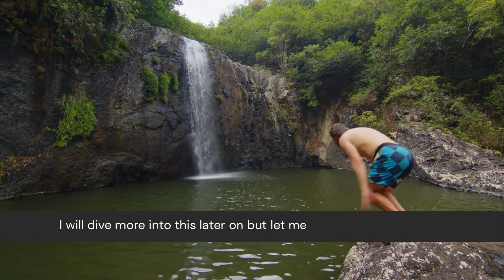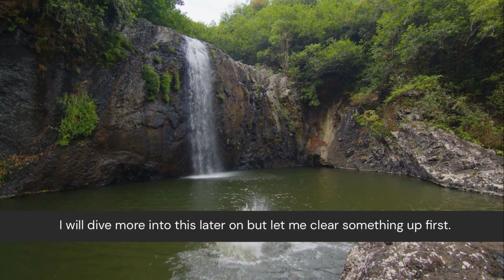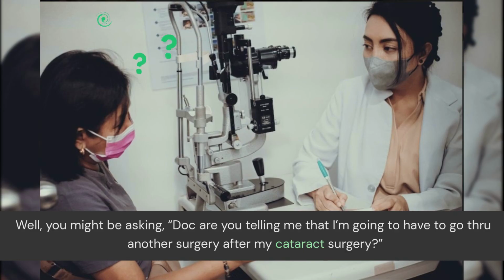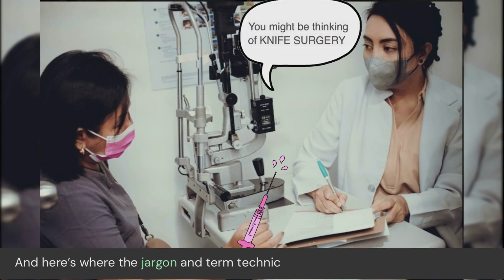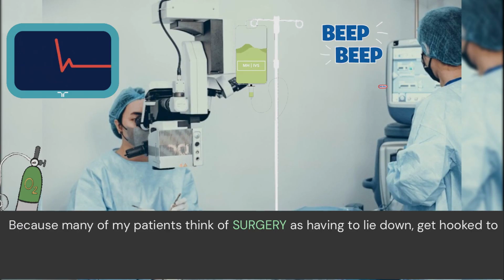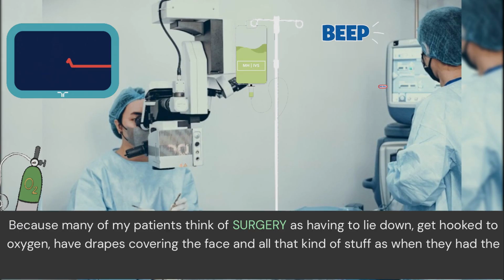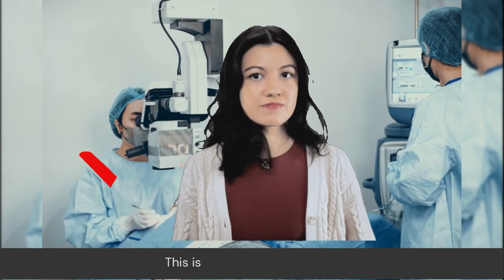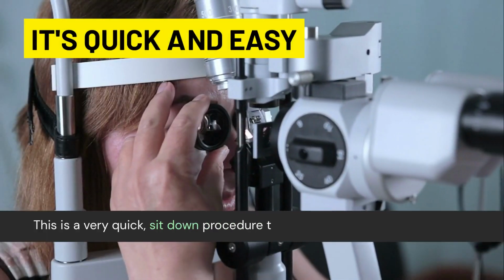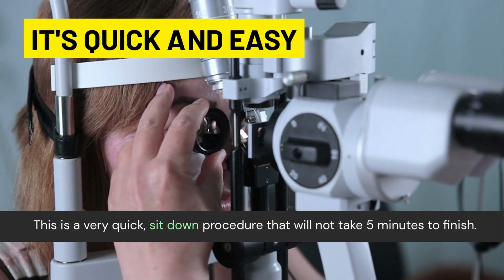Okay, I'm gonna dive more into this later, but let me clear up something first. Because hearing that, you might be asking, Doc, are you trying to tell me that I'm going to have to go through another surgery after my cataract surgery? Because many people, when they hear the word surgery, they think about knife surgery, so they get confused. I know many of my patients think of surgery as having to lie down, get hooked to oxygen, have drapes covering the face, and all that kind of stuff when they had the cataract surgery done in the first place. Pero no, hindi. This is not that type of surgery, huh? YAG is a very quick sit-down procedure that will not take 5 minutes to finish.